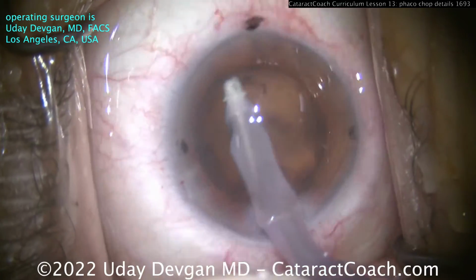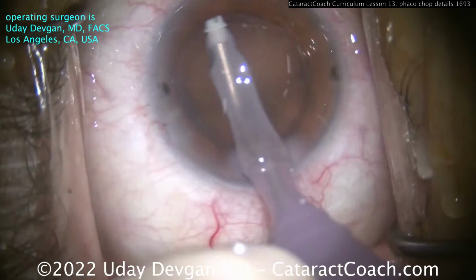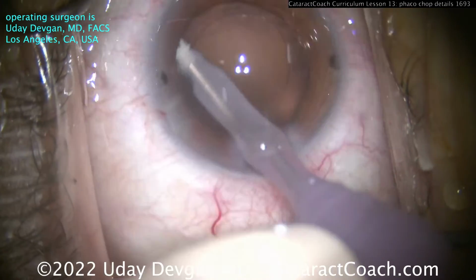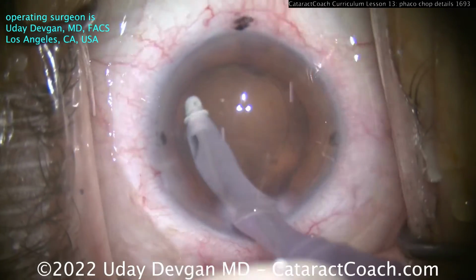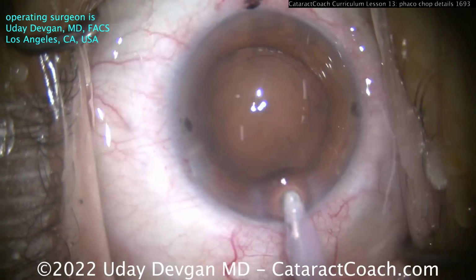So that looks great. Now cleaning up the rest of the capsule here, taking out the cortex, a little bit of capsular bag polishing. And again, this makes for a very efficient surgery. You can see little black ink marks on the cornea, the limbus. Those are at the cardinal meridians.